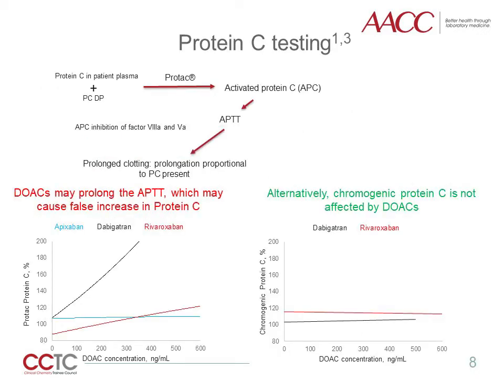Clot-based protein C assays use a snake venom, PROTAC, from the copperhead snake Agkistrodon contortrix. PROTAC will activate the protein C in the plasma, creating activated protein C, which inhibits activated factors V and VIII. As activated V and VIII are inhibited, the clotting time is prolonged, proportional to the amount of protein C present in the plasma. Protein C-deficient plasma is added to the test sample to isolate clot-time prolongation due only to protein C. However, DOACs may increase the APTT clotting time, thus falsely elevating protein C results. There is a variable DOAC dose-dependent effect on clot-based protein C methods, resulting in factitiously elevated protein C levels. Alternatively, chromogenic protein C methods are not affected by either class of DOACs, as demonstrated with no effect of either dabigatran or rivaroxaban on chromogenic protein C results.